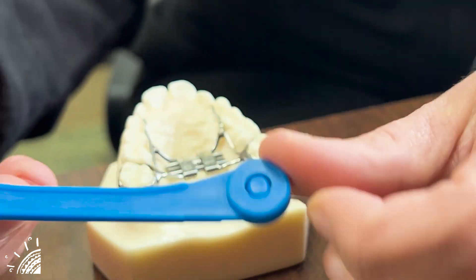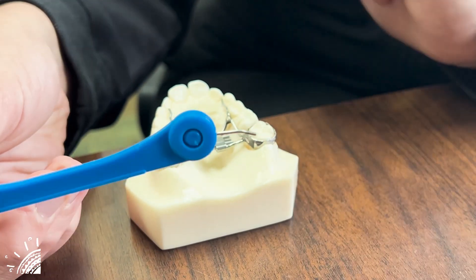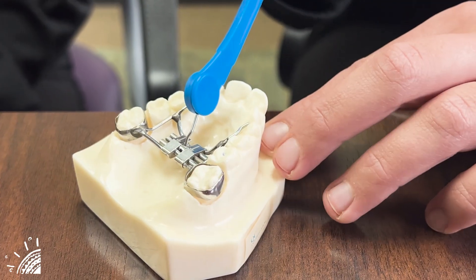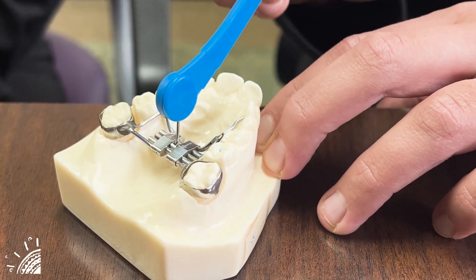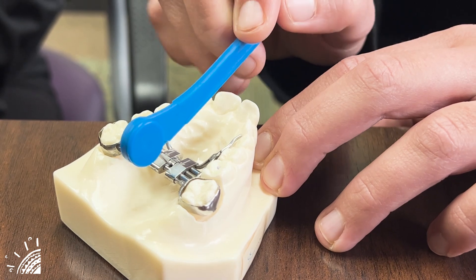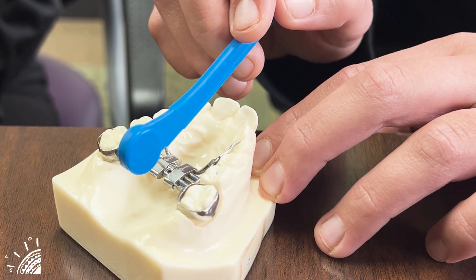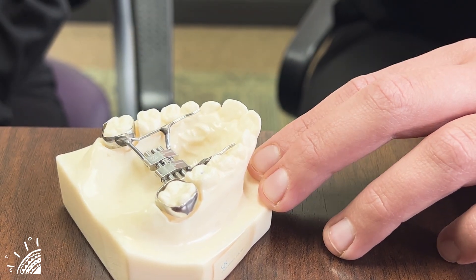When it comes to the key, it does pivot and it also does have a little bend in it. When you insert the key and start to push it towards the back of the mouth, the key will collapse on itself, making it easier for you to take it out of your child's mouth. When taking it out, it is most important to take it out directly and then out of the mouth.